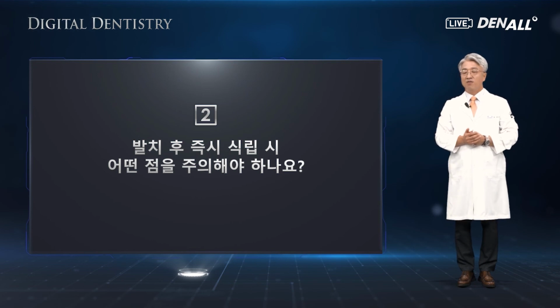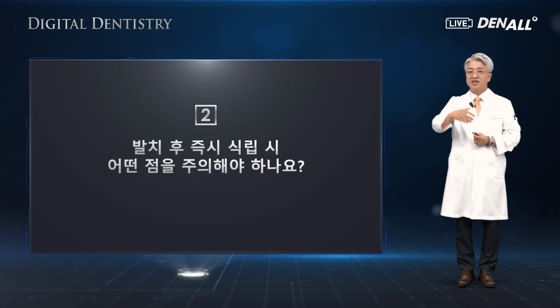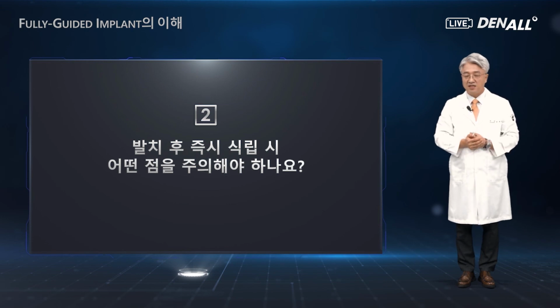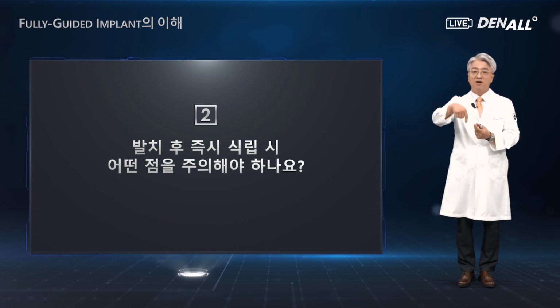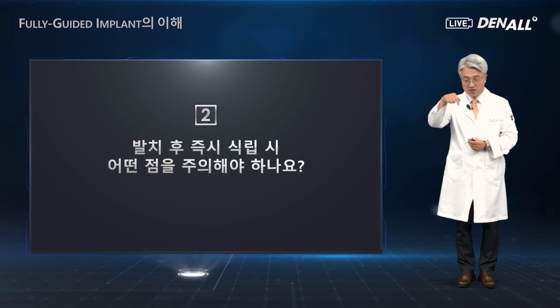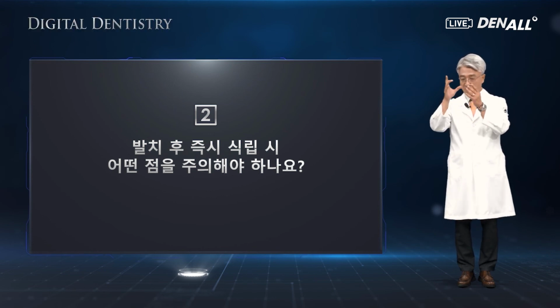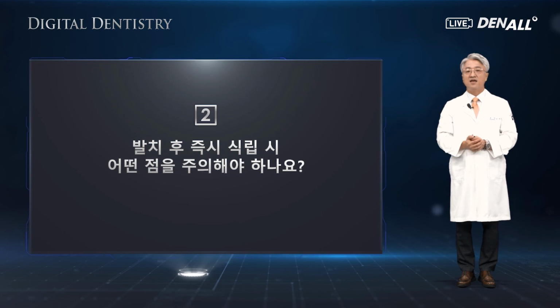In that case, a bone flattening drill can be used, or to prevent the slipping of the drill, you can apply force in the opposite direction, or you can use a path drill from Osstem. The drill doesn't slip as it is designed that way, so that the drill direction is as planned and does not deviate from the plan. That's the most important thing when you do the immediate placement.